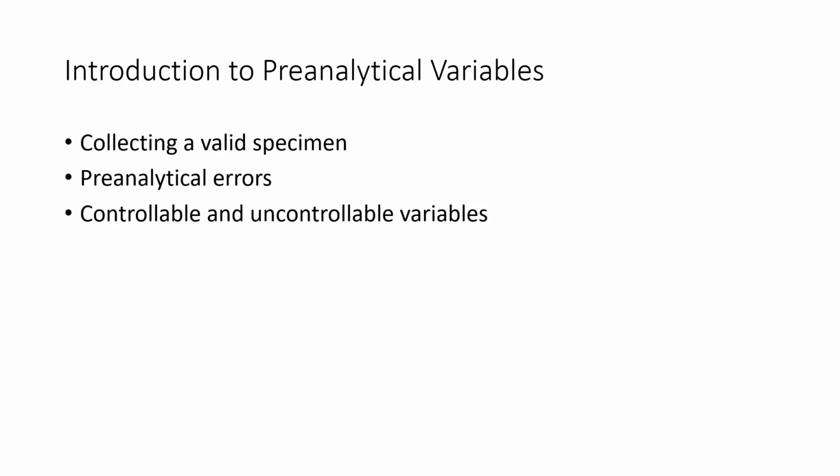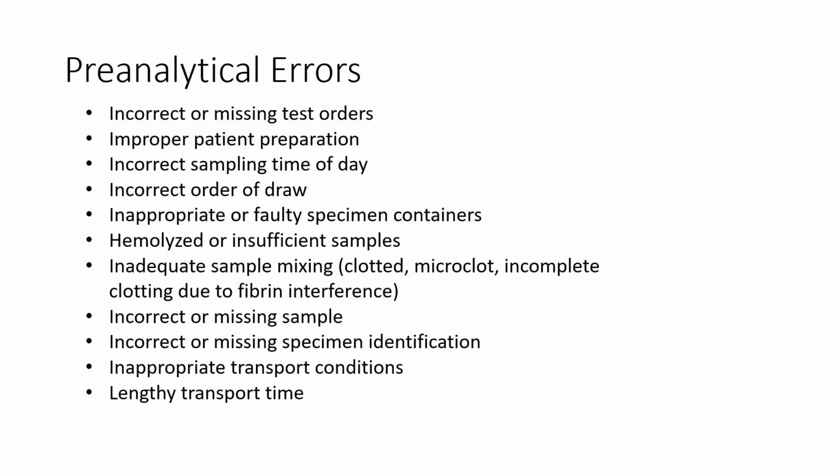Collecting a valid specimen, preanalytical errors, and controllable and uncontrollable variables all contribute to validating patient results, releasing correct or precise results, and diagnosing effectively. Some common pre-analytical errors are listed below.